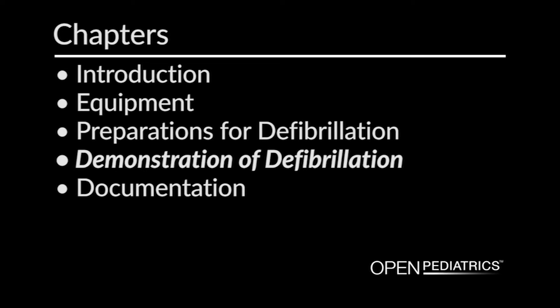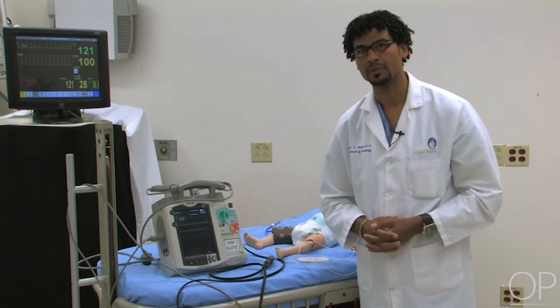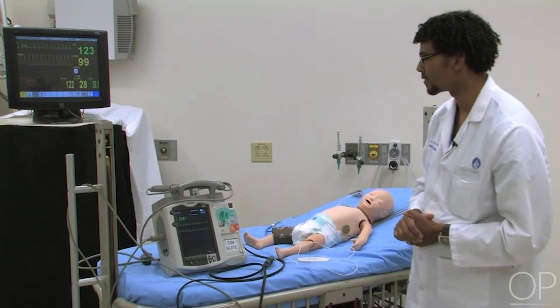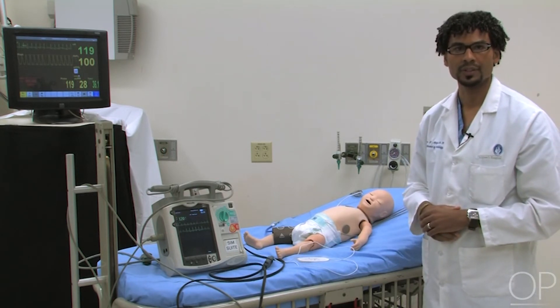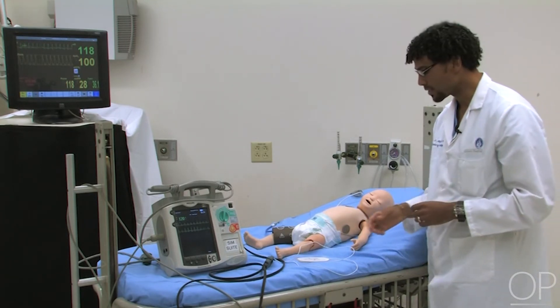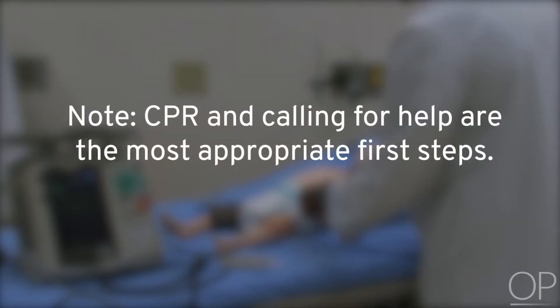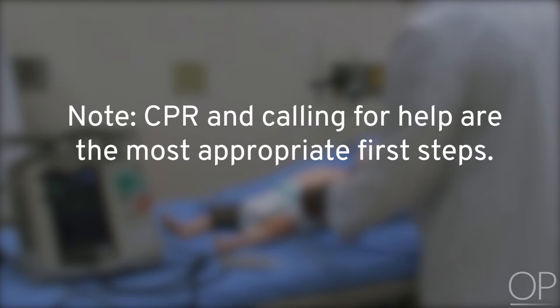I'm now going to walk you through an actual simulated algorithm that mimics the algorithm we use here at Children's Hospital. We have the defibrillator device, a readout of the patient's vitals, and a 10-kilogram infant on the bed for whom we have a clinical worry of arrhythmias. I'm going to place my pads to begin — I have chosen pads for ease of use. Note: CPR and calling for help are the most appropriate first steps; for purposes of this demonstration, we will proceed directly to defibrillation.